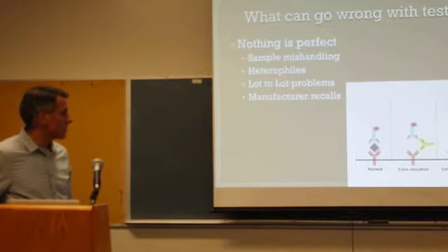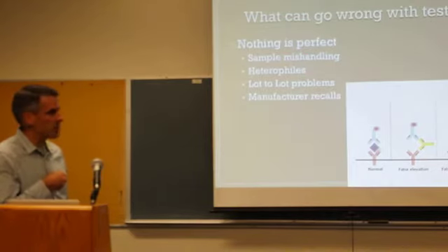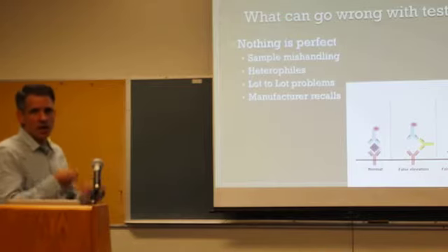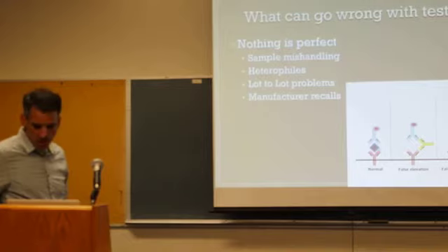Students and residents and doctors tend to believe that the assay is perfect. The other thing we have, occasionally you get sample mishandling, so you might get deterioration of the thing you're measuring. So this sample sat on the shelf. This was a big problem with the old vendor, what we call lot-to-lot variation, because they manufacture these solutions for us in big vats, and not every vat is the same, and you can get changes in the results you get just based on the manufacturing process, which is a bit maddening when you run a lab.